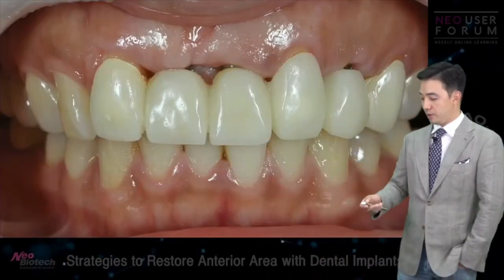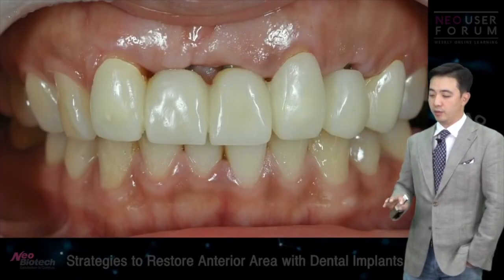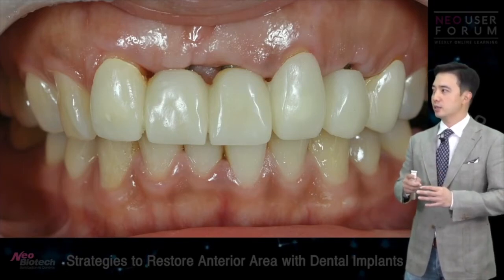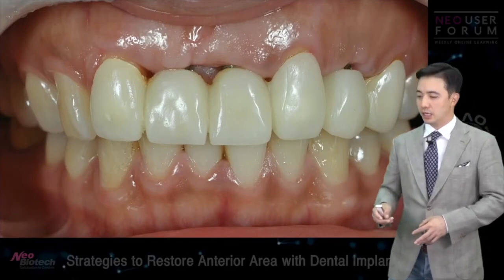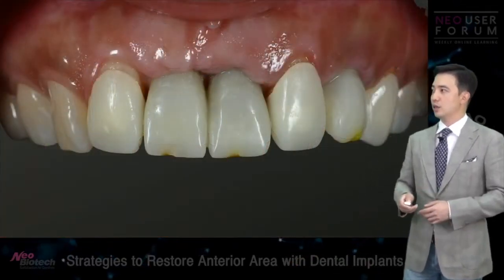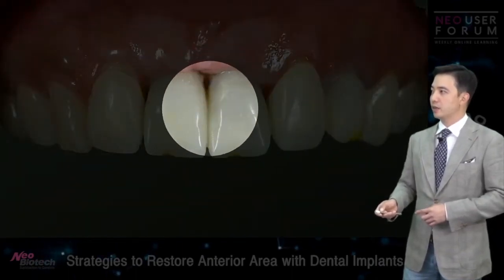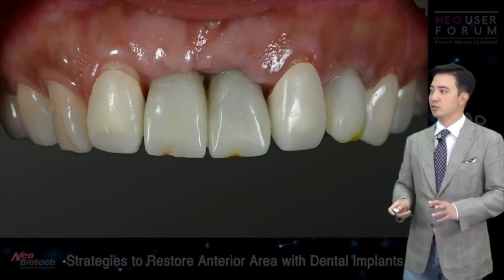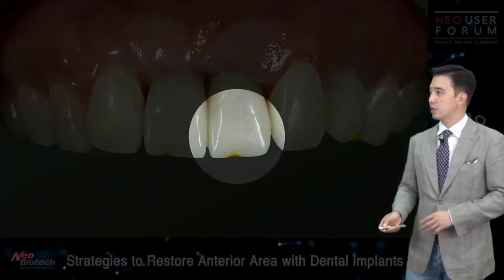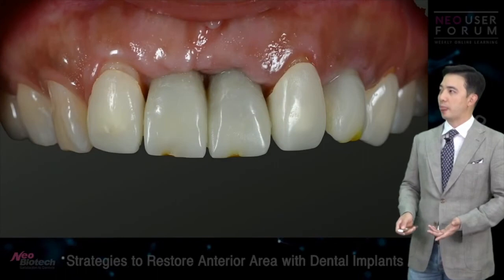Yeah, so these two were pontics for the waiting period before the number 11 and 21 got osseointegrated, and then after I thought those two were osseointegrated, I switched these two pontic areas, so I connected directly to the implant, right? So these two are screw retained provisional restorations on implants. Also, the canine area is also a screw retained provisional restoration.